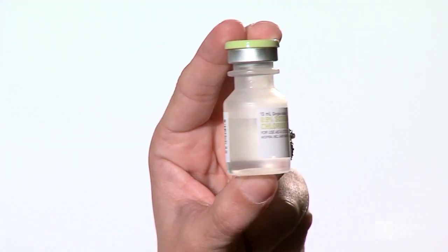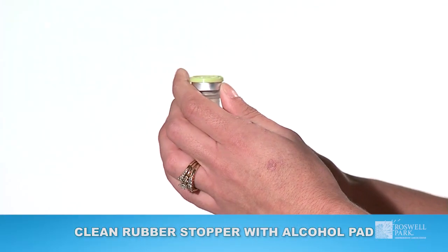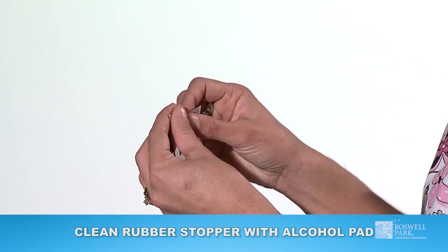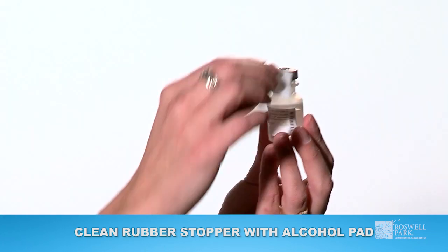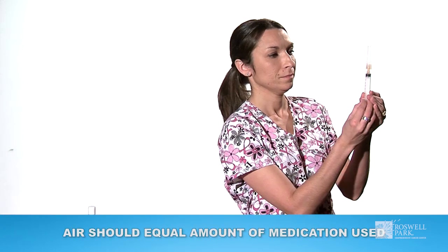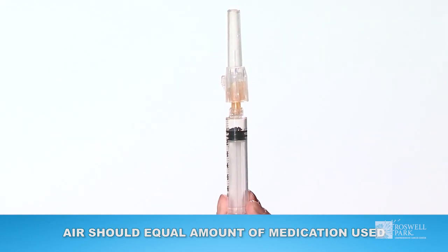If your medication comes in a vial, you will need to draw up your medication. First, make sure to clean the rubber stopper with an alcohol pad. Then, pull the syringe plunger back until the air in the syringe equals the volume of the drug to be withdrawn from the vial.